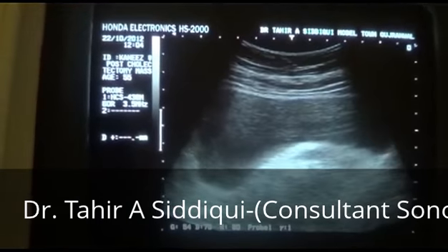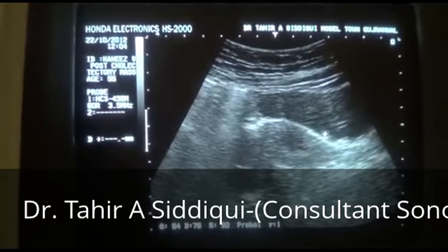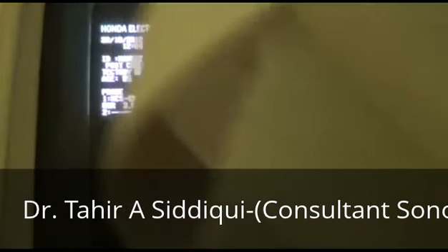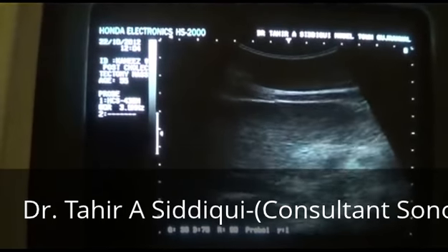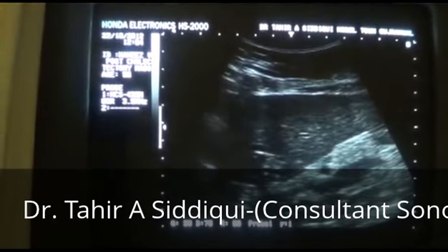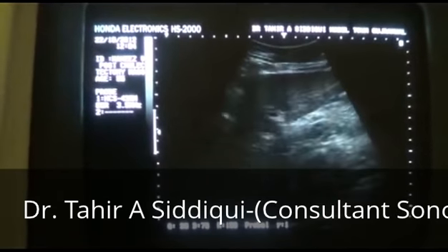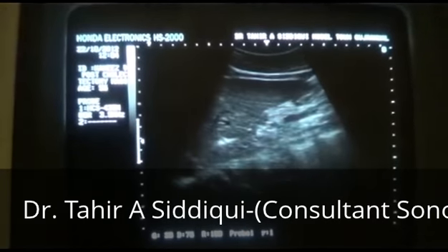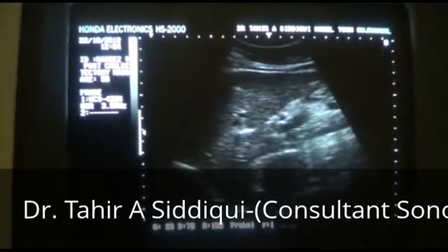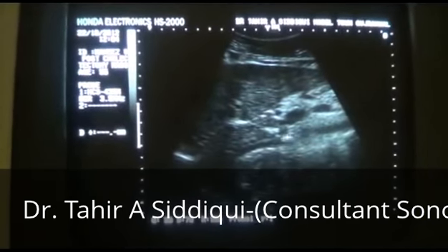This is the urinary bladder. This is the postmenopausal uterus. This area. There is no ascites seen. This is the aorta. This is the IVC. This is the inferior vena cava.